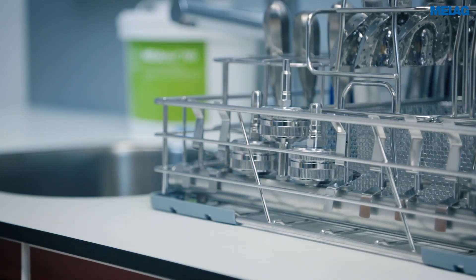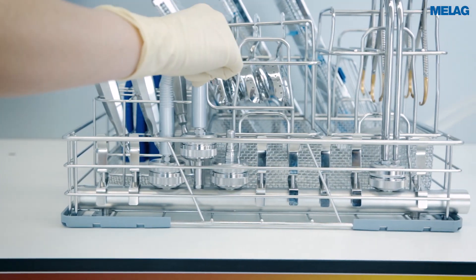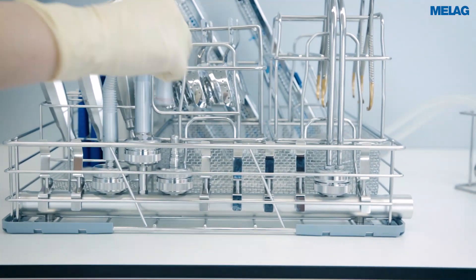After decontaminating the transfer instruments in the Melotherm 10 Evolution, we recommend blowing them out with compressed air and treating them in accordance with the manufacturer's specifications.